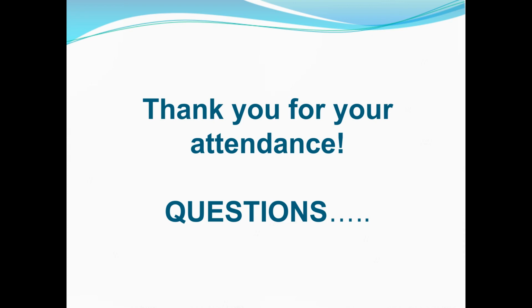All right, thank you. Next question. I might have misunderstood the rationale, but can you clarify again why the 9 non-identified specimens were excluded during your verification of the Sepsityper? So they were excluded because they weren't misidentified. We just didn't get any identification. So therefore, we took those out to look at our numbers because we're not going to put something in where it doesn't have any type of an identification. If it gave us a misidentification, then it would have been included in the numbers.